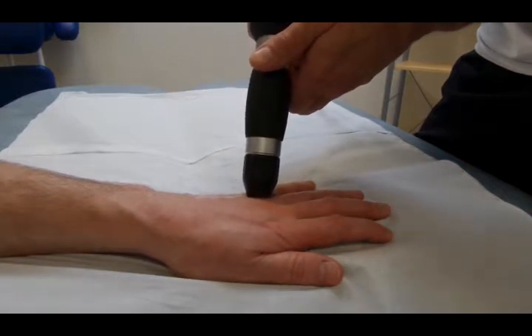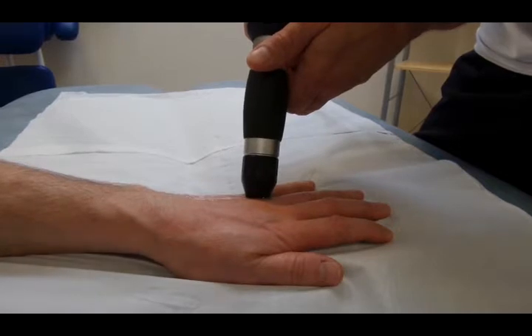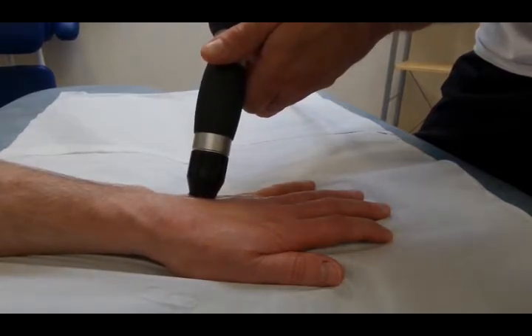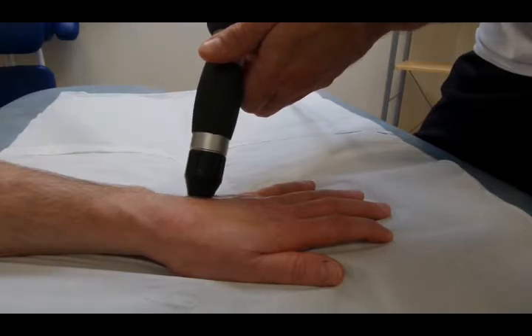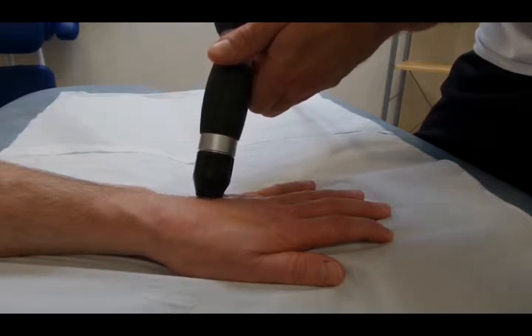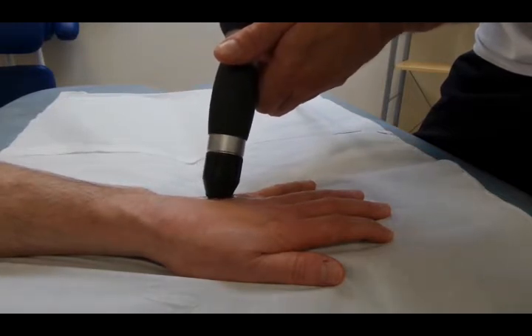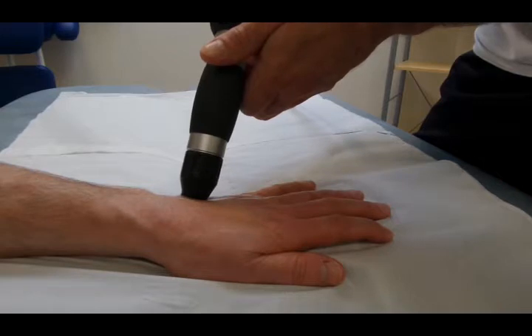Overall he's very pleased with the progress. For a year he really hasn't made any steps forward, and this treatment seems to be working very effectively. This is the 4th treatment onto the hand. We will be videoing the whole series of these and putting them up onto YouTube and the website.